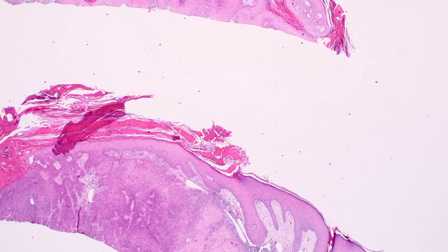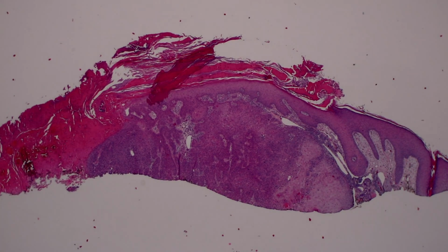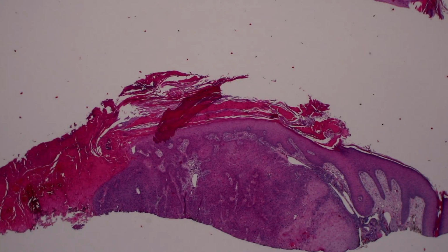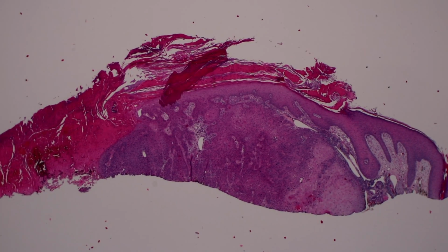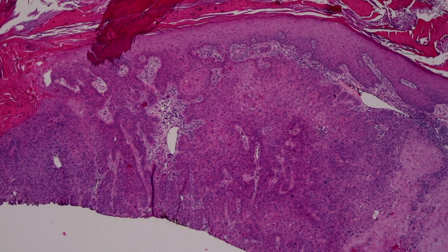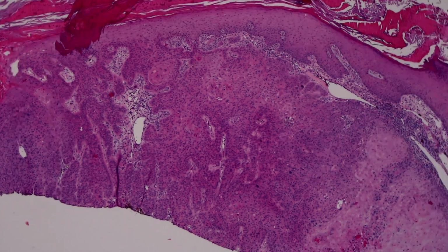I don't say squamous cell carcinoma well differentiated. I just say squamous cell carcinoma, and I don't mention differentiation unless there's something other than usual. Most squams that I see in Dermpath are well differentiated, but if I see ones that look uglier and more sheet-like and atypical, then I will mention if I think it's moderately or poorly differentiated, but I don't usually say well differentiated. I know some people do. This is just my personal style. I'm not saying that you have to do it.